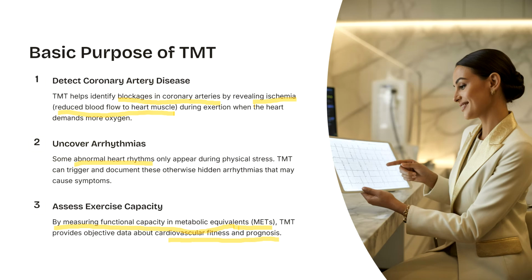So three main things we have to keep in mind, the three basic purposes. One is to detect coronary artery disease. Number two, to uncover arrhythmia. Number three, to assess the exercise capacity of the person.